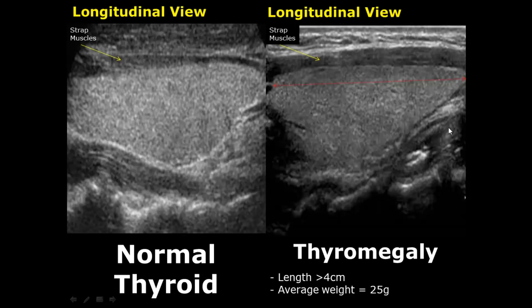Another term commonly used for thyromegaly is goiter, which is also the abnormal enlargement of the thyroid gland. This can be due to many reasons such as nodular hyperplasia, cancer, or thyroiditis — we will see all these cases now.